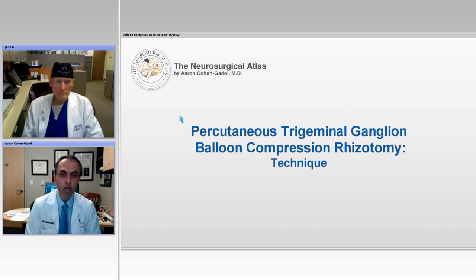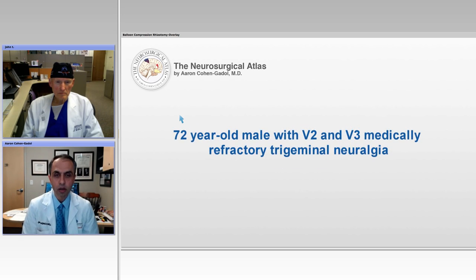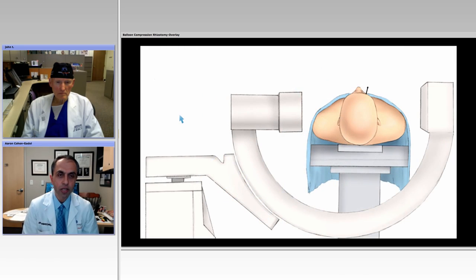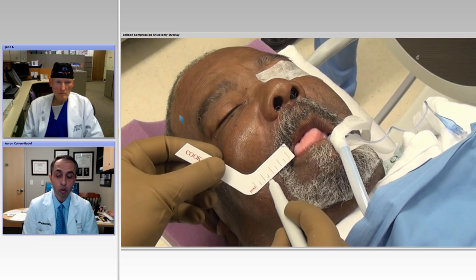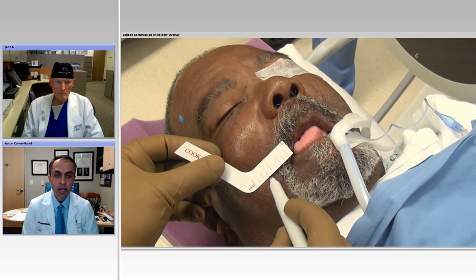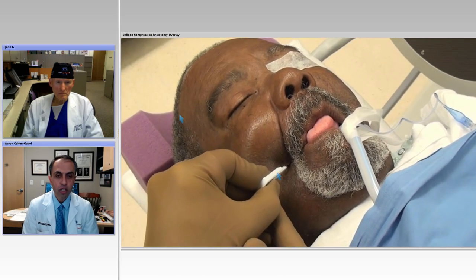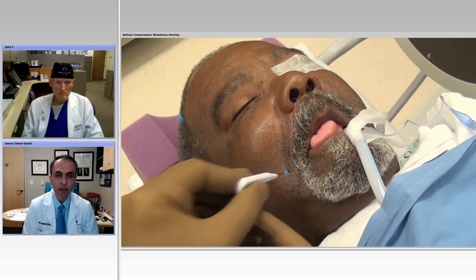So let's talk about percutaneous trigeminal ganglion balloon compression rhizotomy. In a case of a 72-year-old male with V2 and V3 trigeminal neuralgia, the setup for the room is very classic. Again, we emphasize the importance of fluoroscopy. And you can see in this video we use a ruler to measure the distance of about 2.5 centimeters.